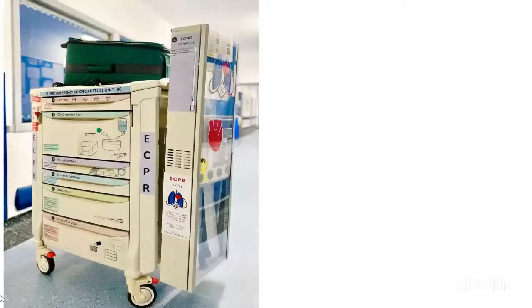So the other important thing, we come to the logistics now. Once we have gone through the counseling team, procedural team, and support team, here we can see an ECPR trolley. If you see it properly, there are multiple compartments, and everything is already prepared for ECPR. On the side we have multiple size cannulas available, and here you see the numbers of the cannulators, first cannulator, second cannulator. These might be the duty mobiles also.